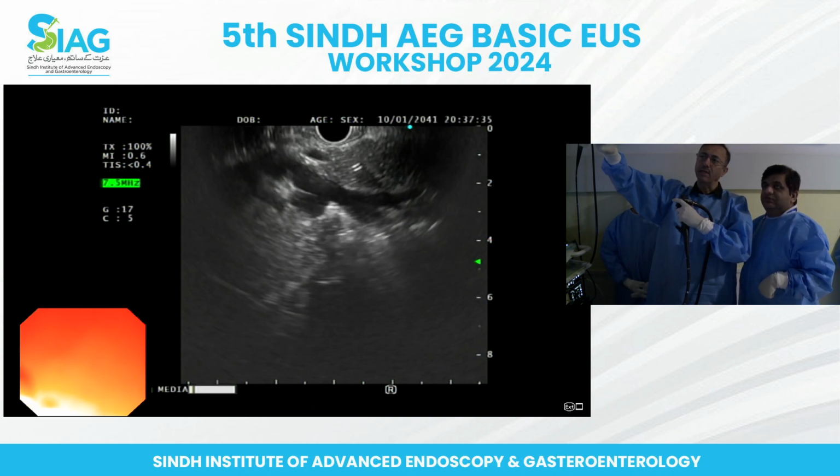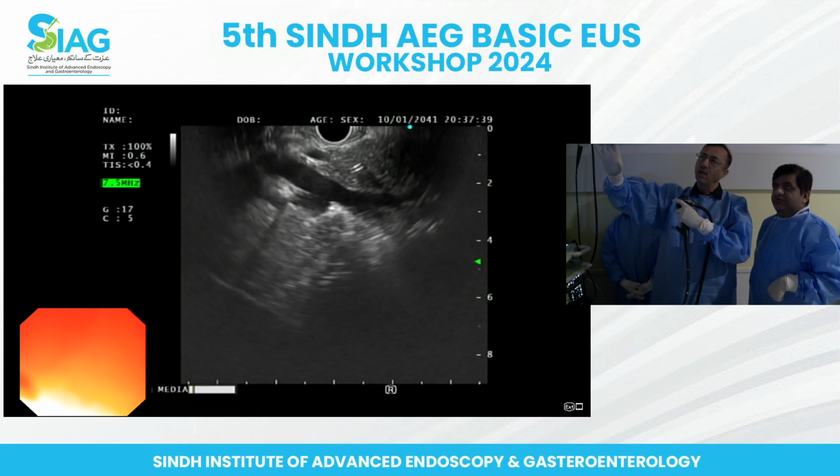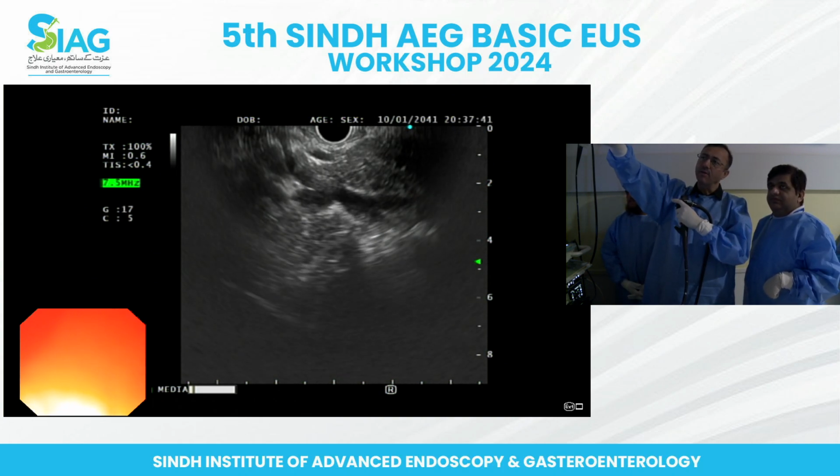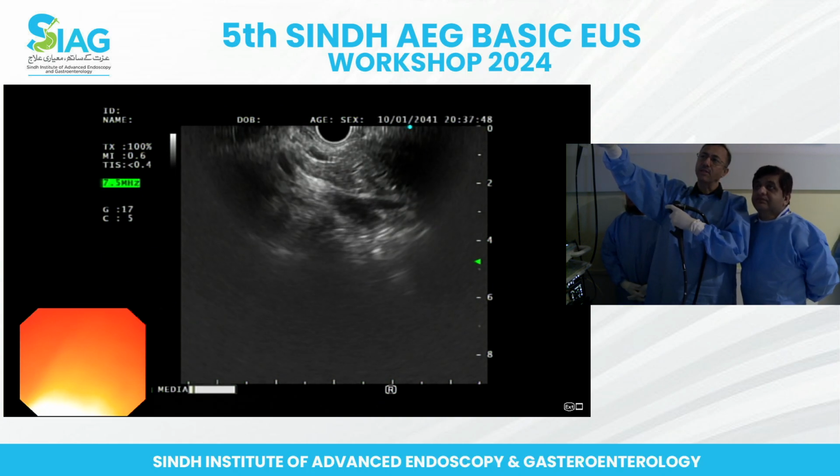And what do you see in the pancreas? And what would you like to see in the pancreas? It's the pancreatic duct that you like to concentrate on. Over there we can see some kind of tubular structure, parallel lines. Now these two parallel lines, most likely somebody has placed a stent.